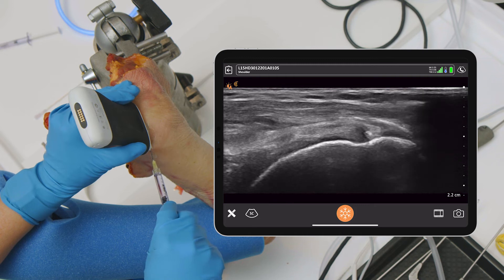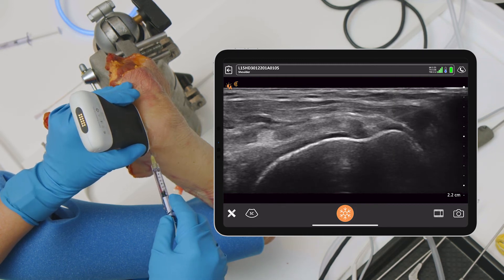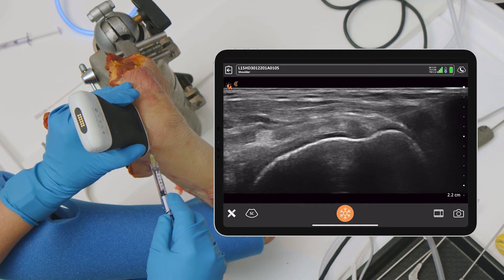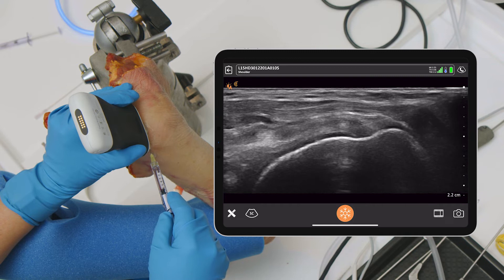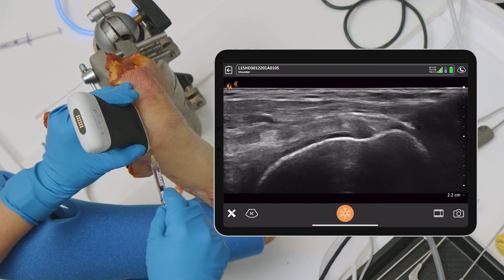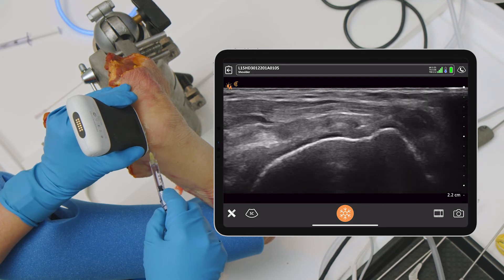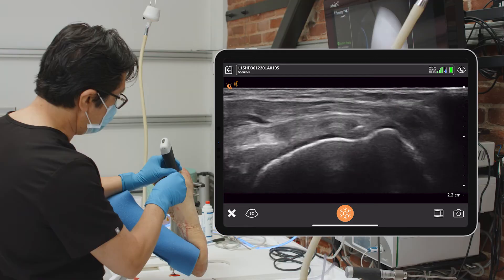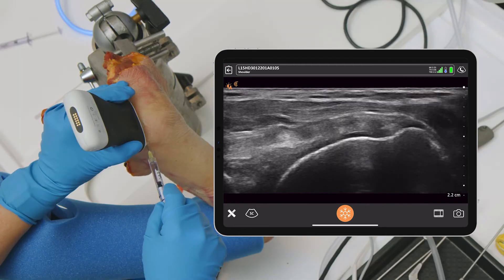I'll change my angle here and come in a little bit more angled. You can see I'm right in the shot, right there into that partial tear. Now you can see the needle going into that partial tear, seeing it right in that area. So you can get more into that spot in the intra-articular portion — I'm actually into the actual tendon tear now. There's our needle, and you can see I'm right into that area of the tear.